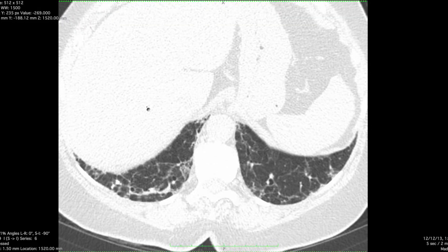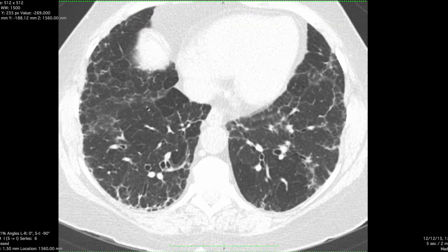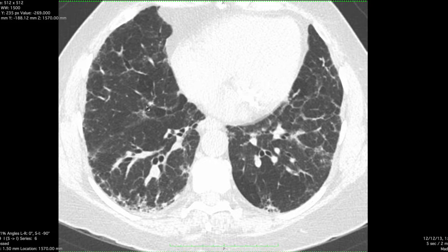Mosaic attenuation has its three-part differential diagnosis. An infiltrative abnormality which spares adjacent secondary pulmonary lobules can give you mosaic attenuation. But more often than not, it's going to be due to air trapping, sometimes from small vessel disease, either from pulmonary hypertension or from chronic thromboembolic disease.